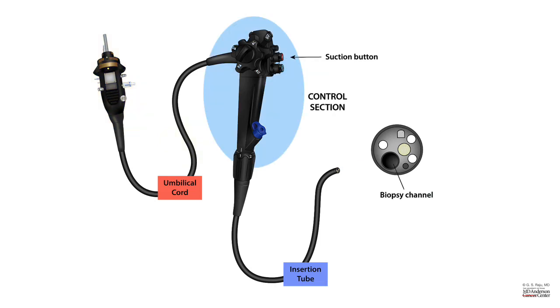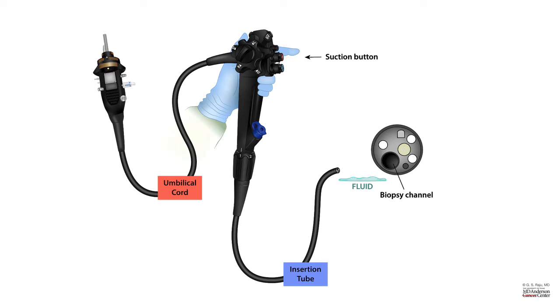Here is a biopsy channel, and if you press, or the suction channel, biopsy channel and suction channel carry the pathway in the insertion tube as a common pathway, and then once it goes to the control section, it splits into two. So the suction button is a red button, and if you press on the suction button and depress it down, it sucks the fluid, and the fluid goes up the insertion tube to the umbilical cord and then out through the suction connector.